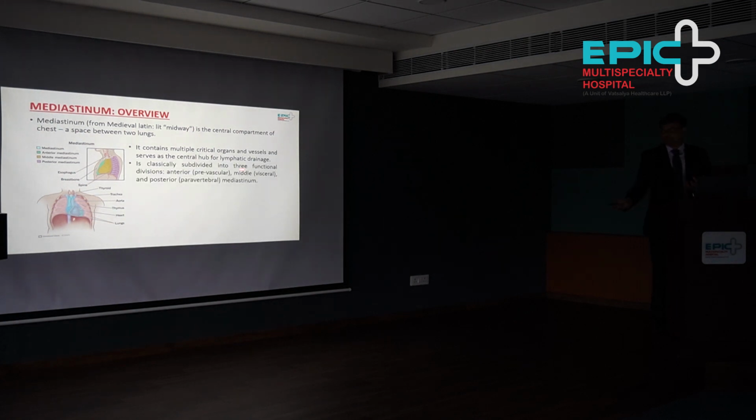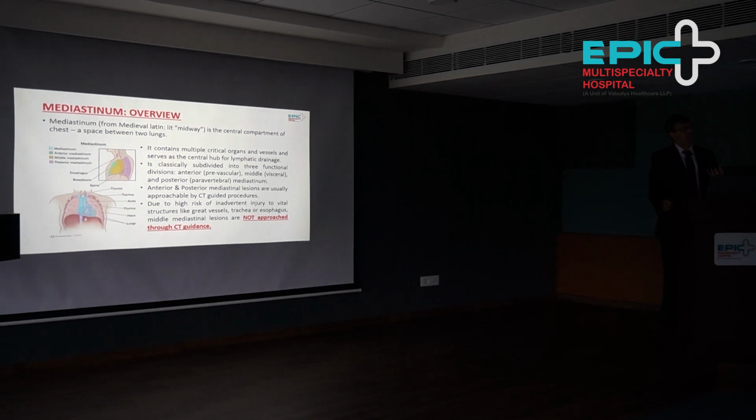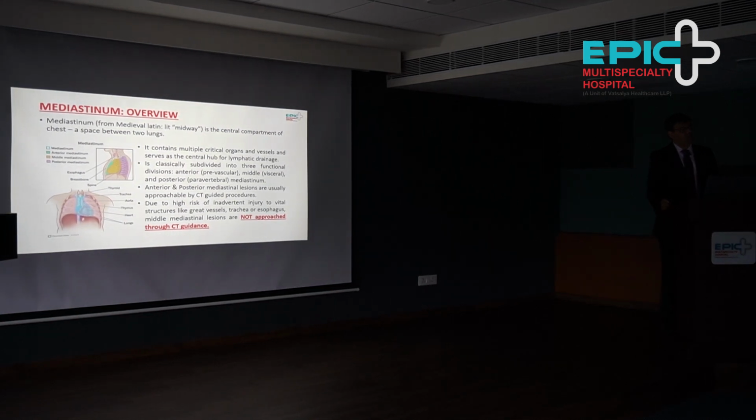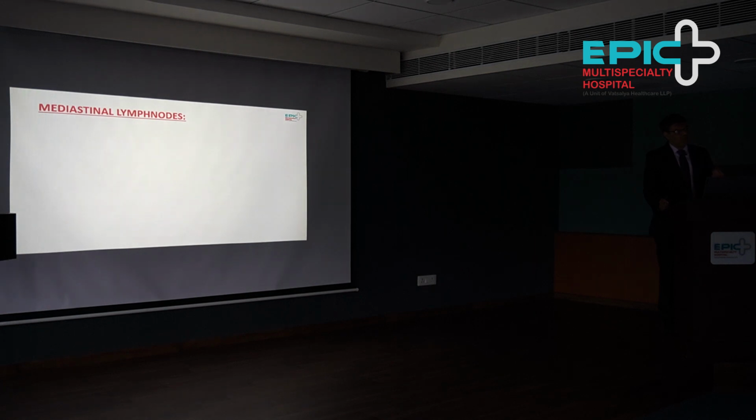In the anterior and posterior mediastinum, the pathologies are usually addressed with CT guided procedures. While in the middle mediastinum, because of the high risk of inadvertent injury to critical organs like the heart as well as the great vessels of the body, they are not approached with CT guidance. That's why EBUS comes in and plays a big role.